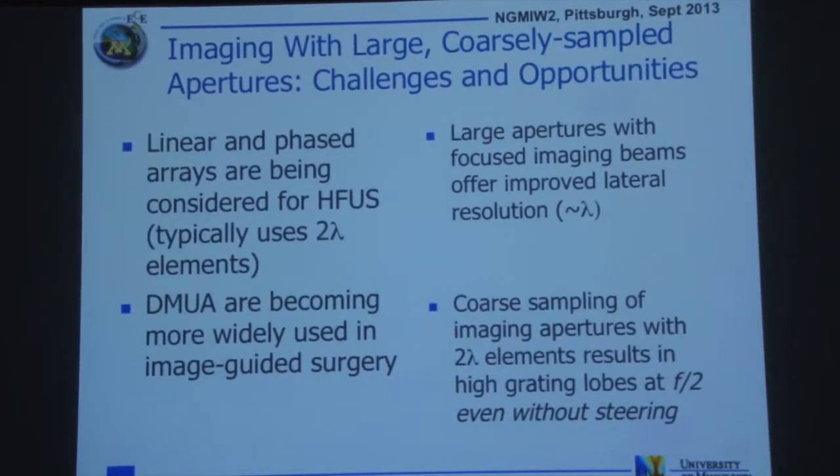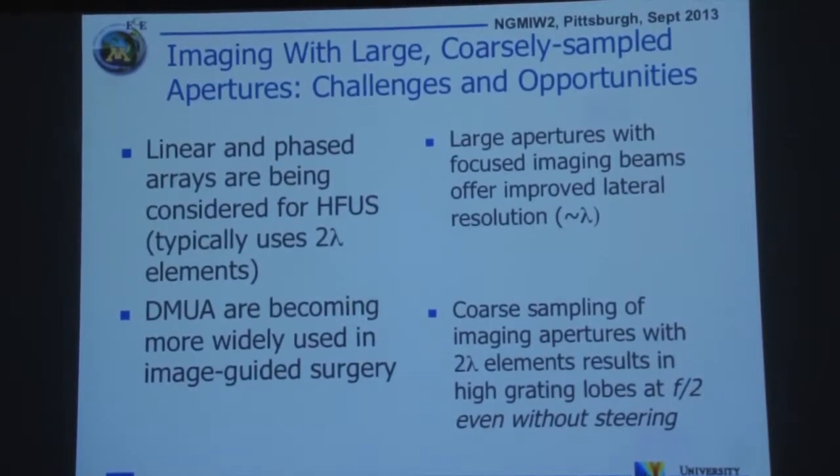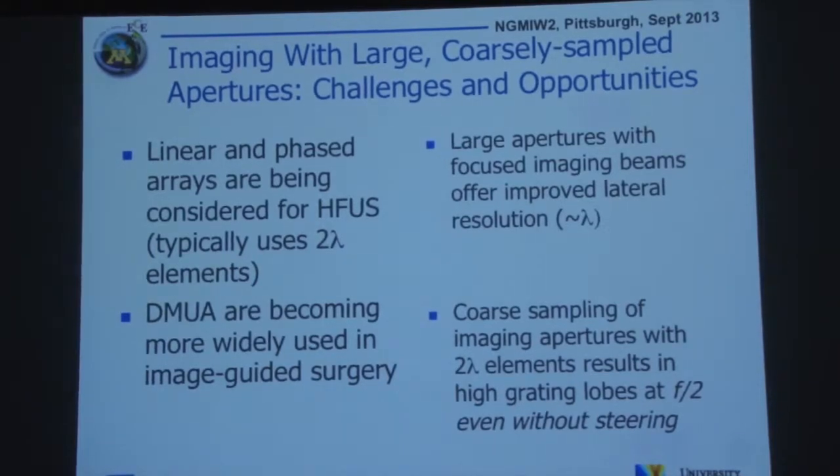So with DMUAs, you have fairly large apertures, generally concave apertures, so they're highly focused. And because of the large aperture, the sampling is typically coarse. We don't try to go lambda over 2 to get high quality, conventionally focused beams, but we typically have 2 or 3 lambda spacing between the elements. So again, in this case, focusing with the coded waveforms can be a key to restoring the focus and clarity.